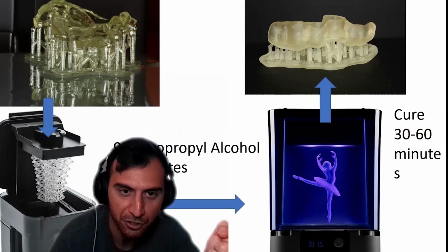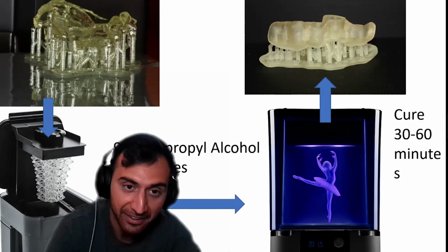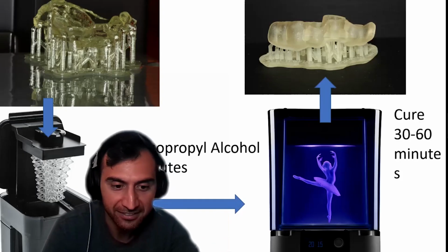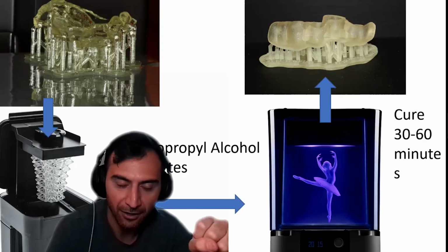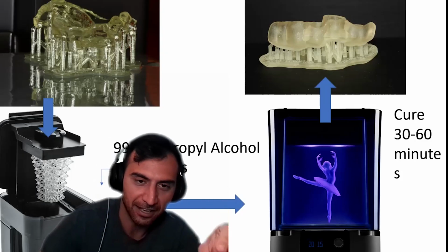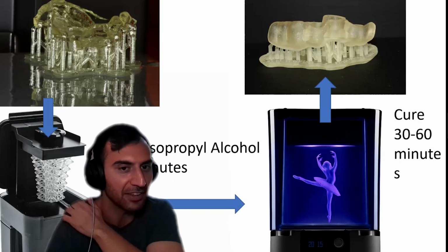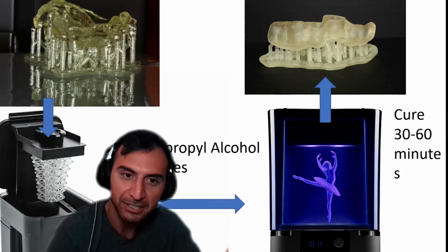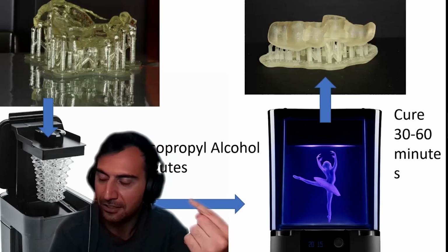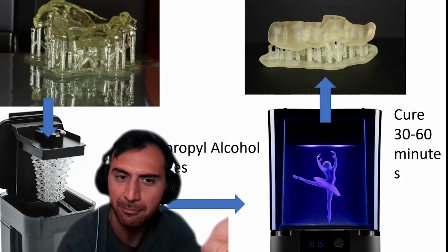And most of these machines have a designated bath for their 3D printed guides, an alcohol bath. I used to just use a tub of alcohol, like a plastic Tupperware container, and dip it in there, and then have one of those magnetic spinning spools that we used to use for beakers that would spin the alcohol to clean it. And I would just dunk it a bunch of times. That was really inefficient and messy.